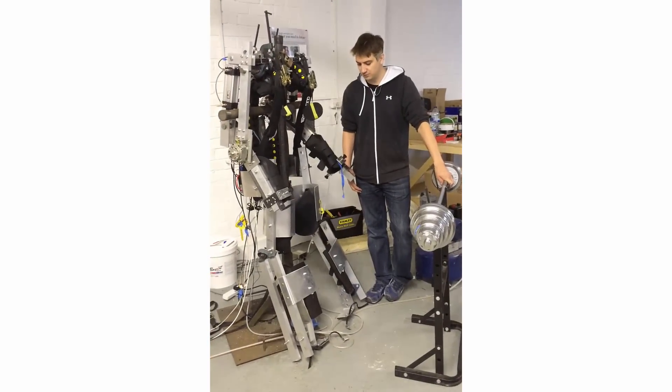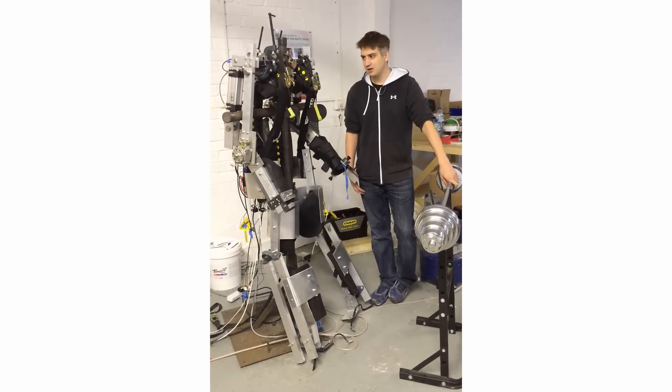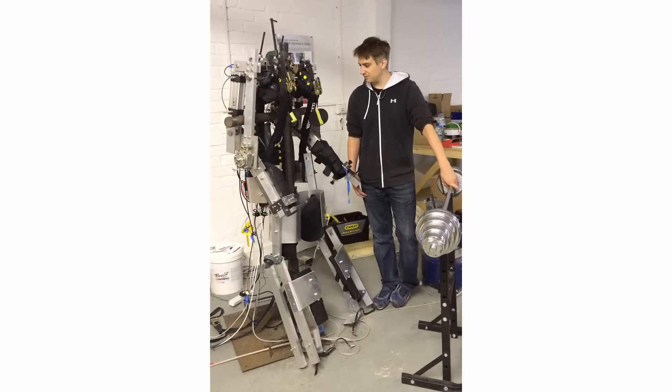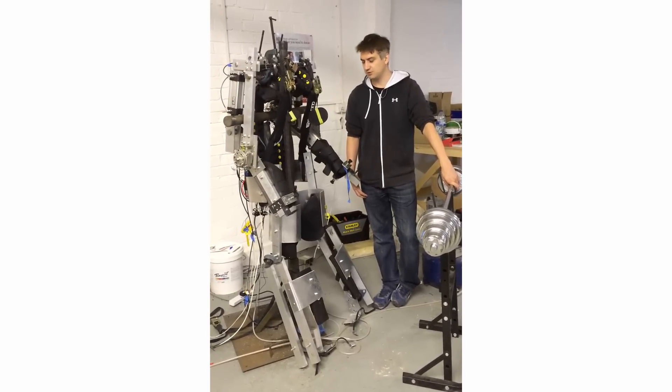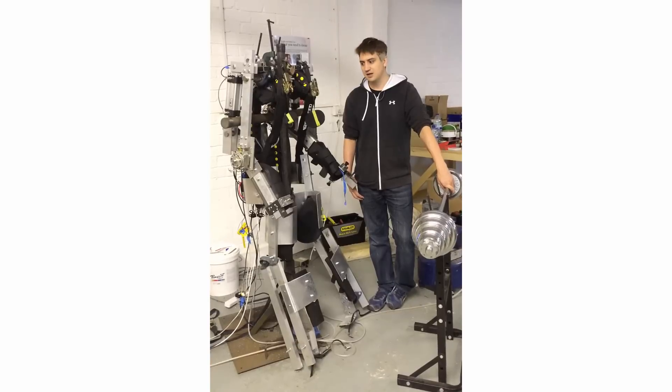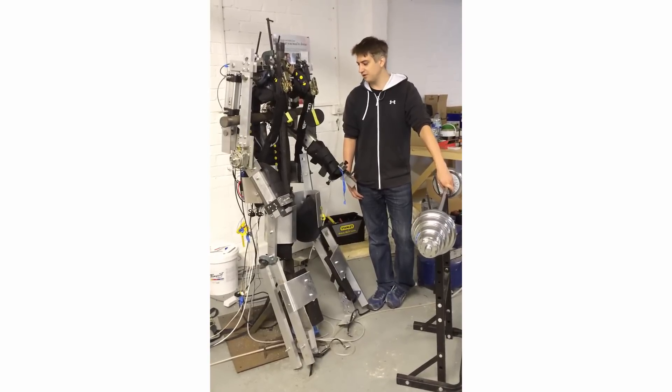This is a brief introduction to my prototype exoskeleton. It's controlled by an NI cRIO module, which is an FPGA module and uses 24 volts. It has no operating system, which makes it very reliable.